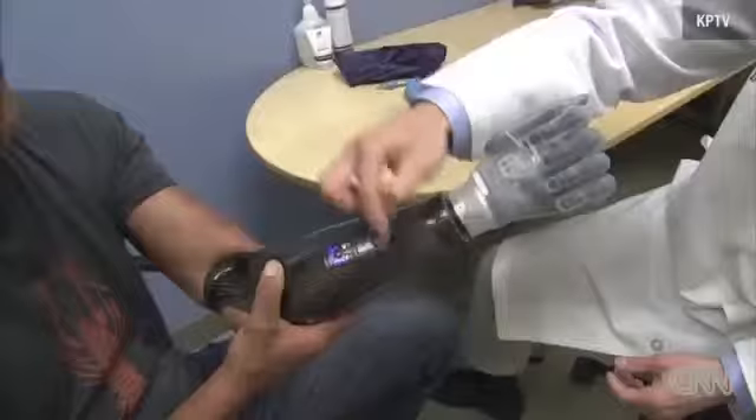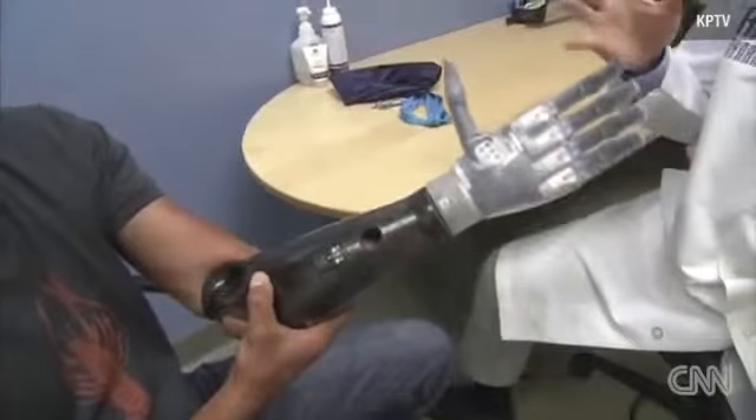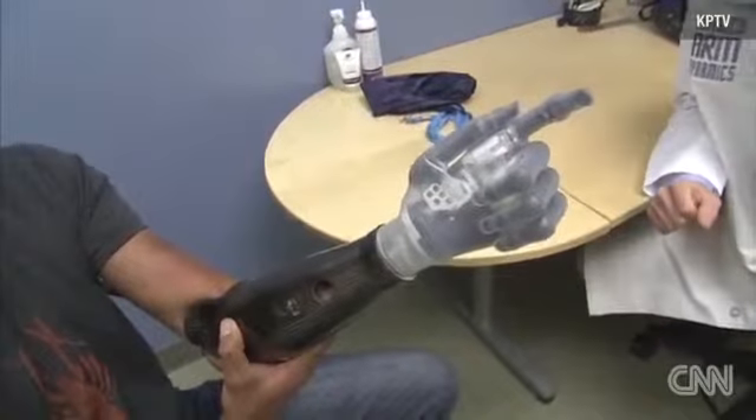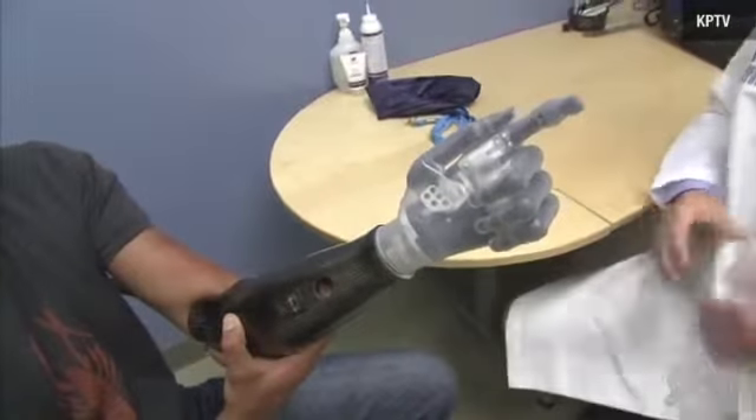The outside muscles — the extensors — are going to be your open. The inside muscles — the flexors — are going to be your closing. That was me telling it to do that, huh?